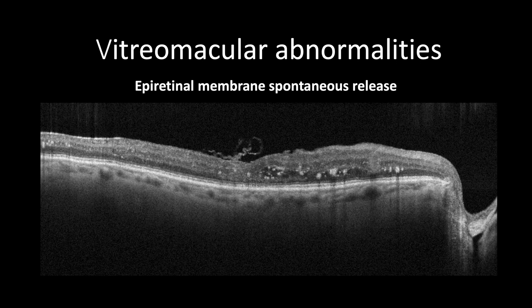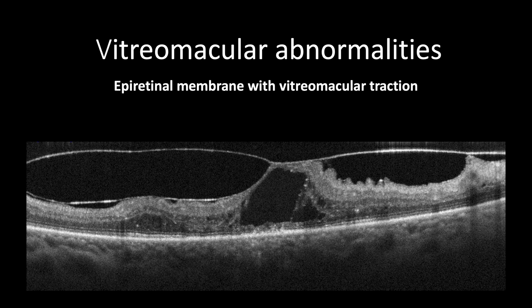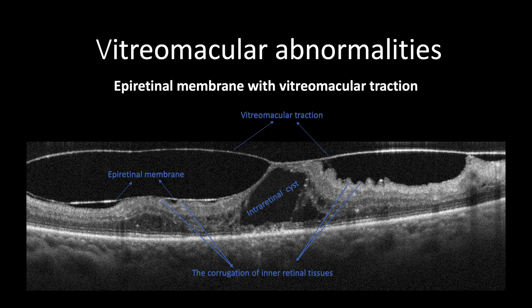In cases where the epiretinal membrane detaches spontaneously, it will look like a scroll located next to the inner retinal surface. However, cases presenting with both epiretinal membrane and vitreomacular tractions will have retinal features of both entities, and sometimes splitting of the posterior cortical hyaloid is seen on OCT.